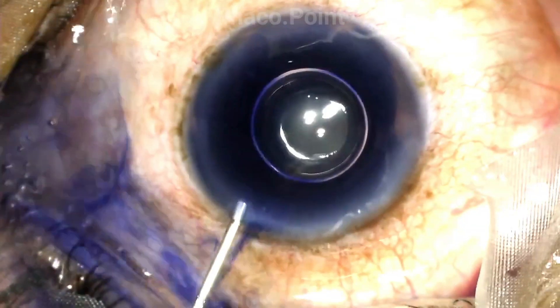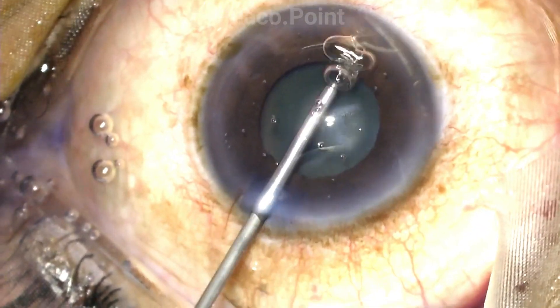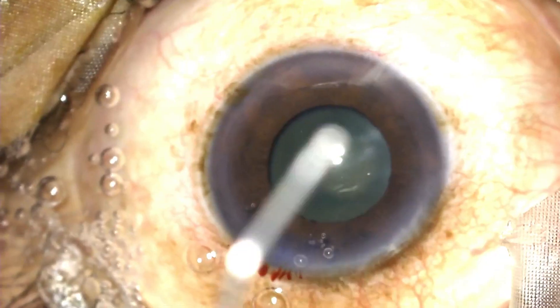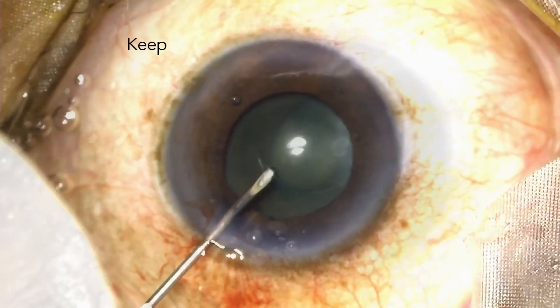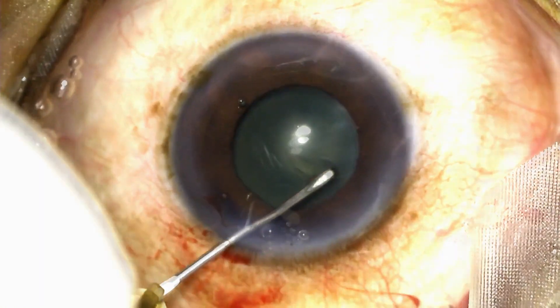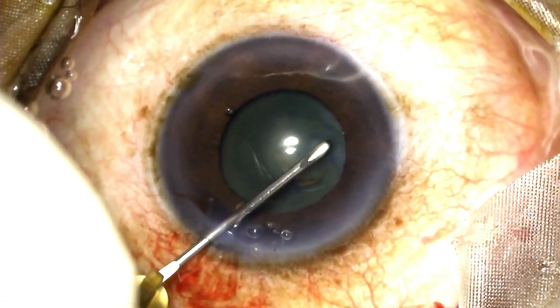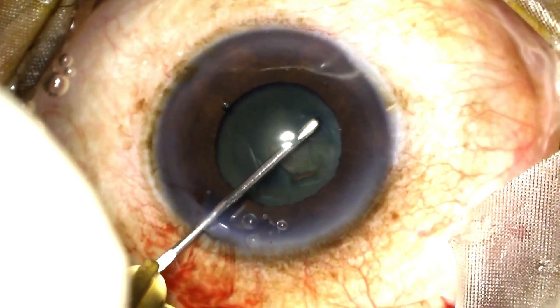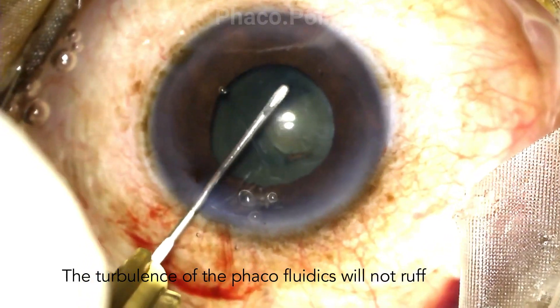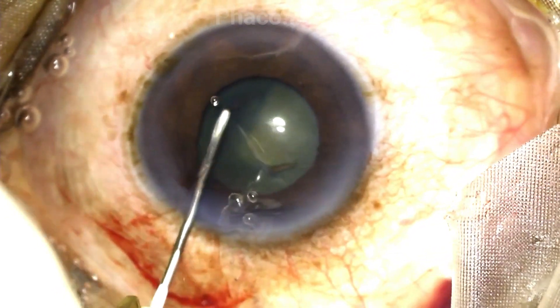After staining the anterior capsule suitably and washing it out under viscoelastic, I now proceed to perform the capsular rhexis. It's extremely important to maintain the capsular rhexis just within the pupillary edge. You then have visibility of the rhexis edge throughout the surgery, you ensure you don't damage it, and all the fluid that goes in and out of the bag comes right out within the rhexis edge. There's no unnecessary ruffling of the pupillary edge, thereby negating any further reduction of the pupillary size.